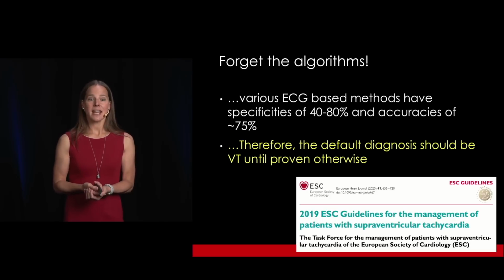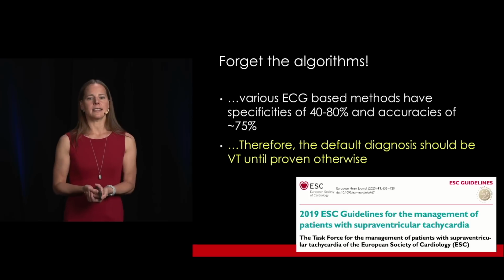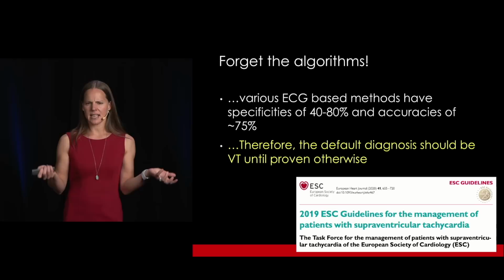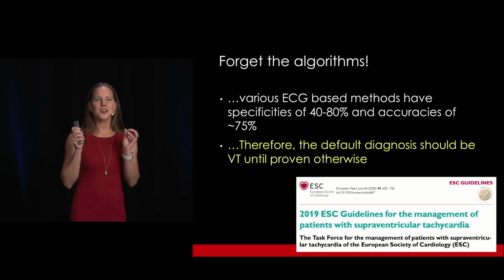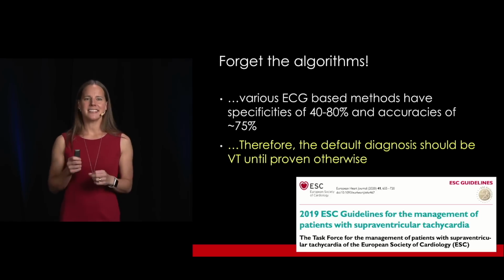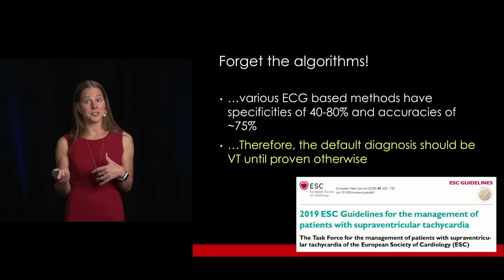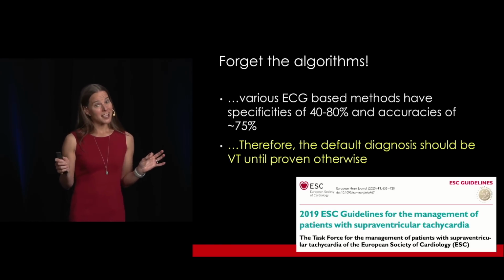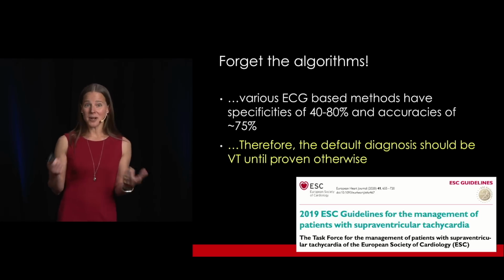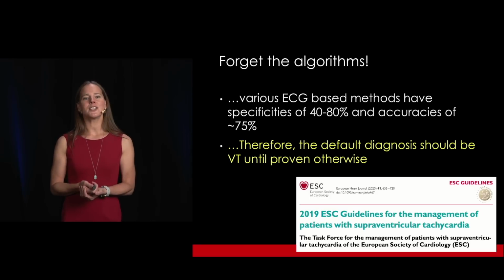Forget the algorithms. And actually, these are the 2019 European Society of Cardiology guidelines. For the management, it says SVT, but it also covers wide complex tachycardias in this paper. And they agree with this. And this is what the guidelines state. Various ECG-based methods have specificities of 40 to 80% and accuracies of about 75%. So if you use the algorithms, you're going to mistake about 25% of these cases. So therefore, the default diagnosis should be VTAC until proven otherwise.